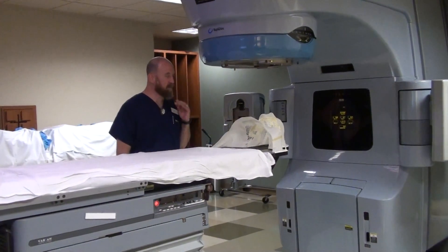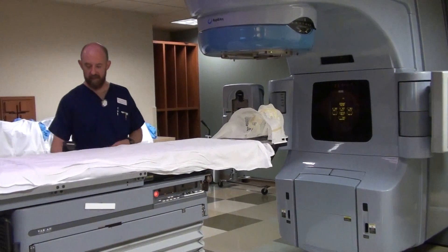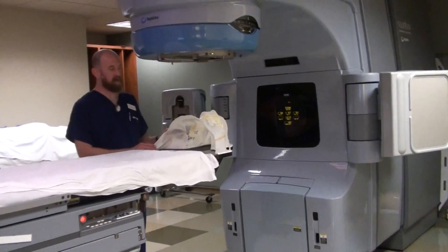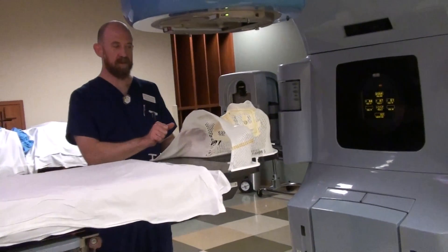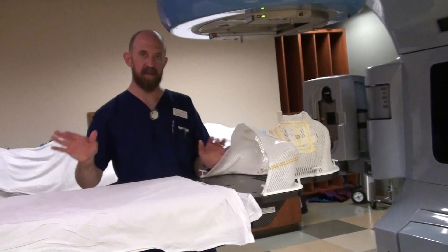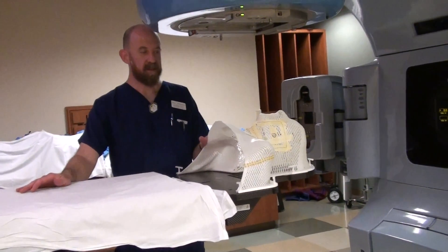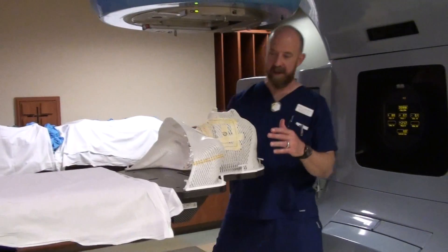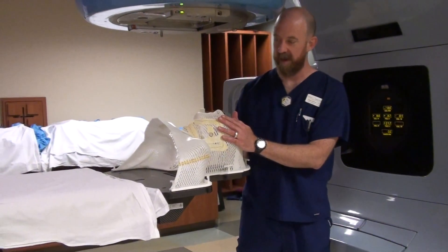For head and neck treatment, normally you're going to have a long mask — at least we do in this part of the country. Sometimes you have a short mask, and if you do have a short mask, you're going to have to make sure that you have a way to get the shoulders retracted inferiorly in the same way every day. For expediency's sake, we're going to use this long mask that, when it goes on to the patient, it actually holds their shoulders and their head in the same position each and every day.